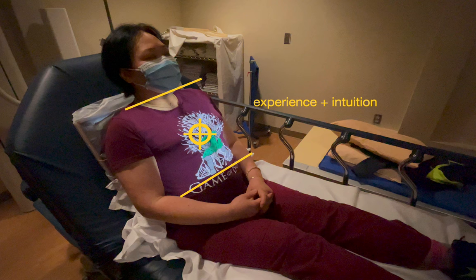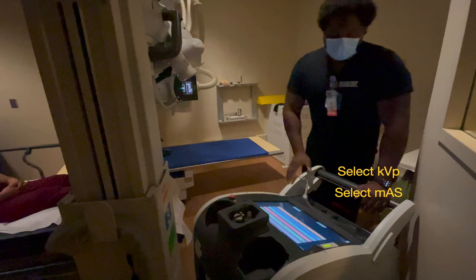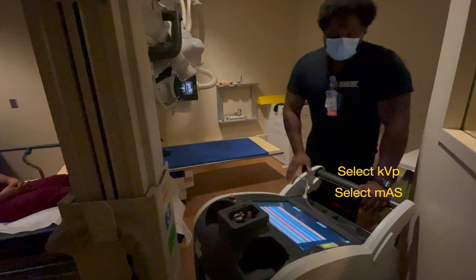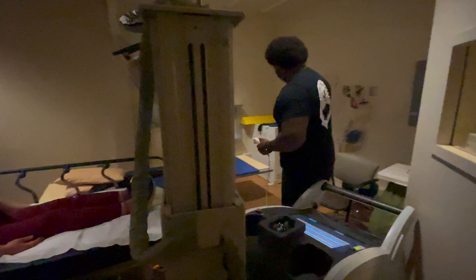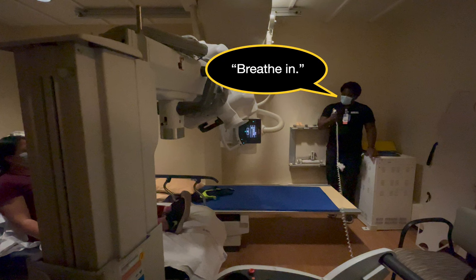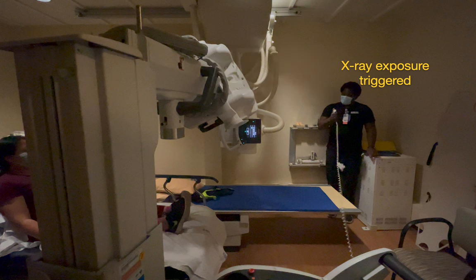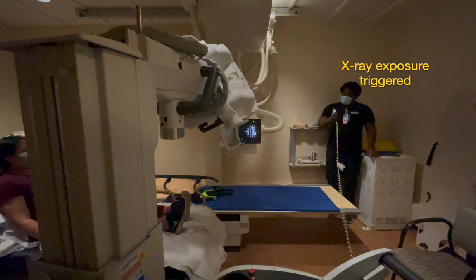Once the x-ray tech is satisfied with the placement of the x-ray detector panel and the x-ray beam, they'll choose the appropriate peak voltage and current for the x-ray tube for this particular patient. The x-ray tech will then take the trigger button and put some distance between themselves and the x-ray tube. When it's time to take the patient's chest x-ray, they'll ask the patient to breathe in, breathe out, and then breathe in, and they'll trigger the x-ray exposure at the end of the patient's second breath in to hopefully get a nice well-expanded image of the patient's lungs.